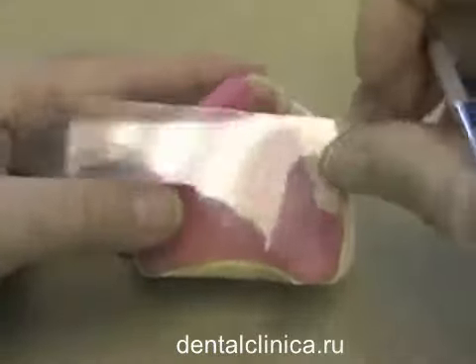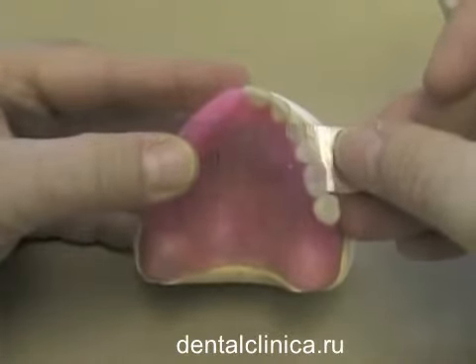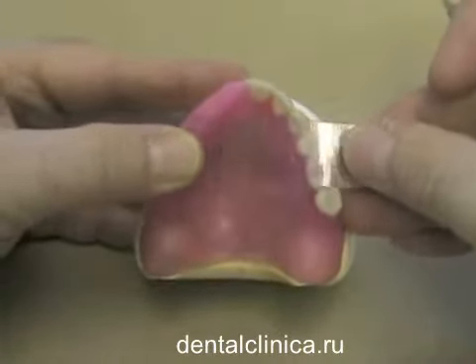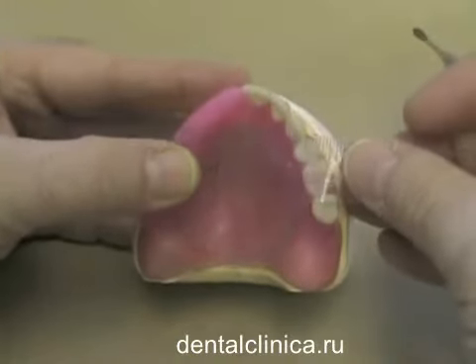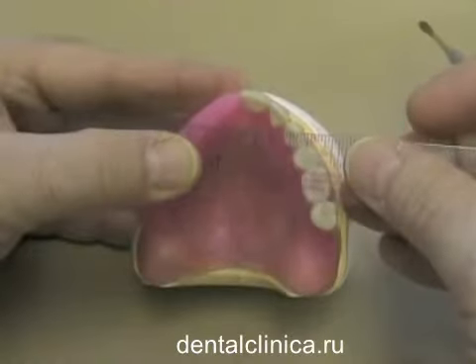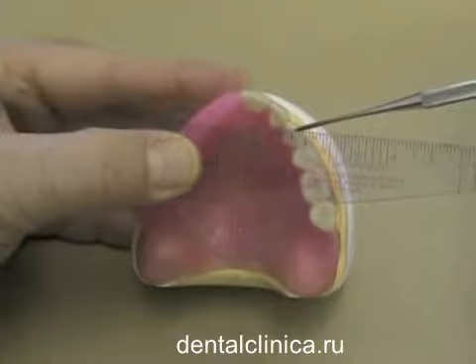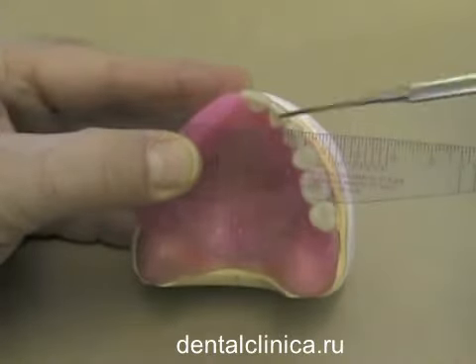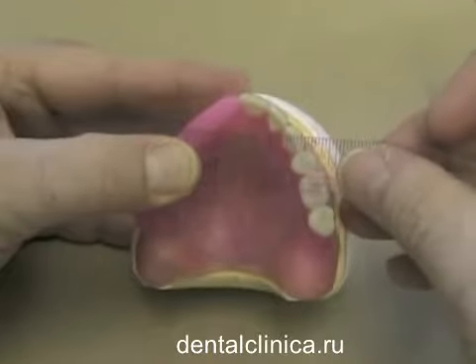That will help us when we want to determine where that anterior reference line distal to the incisive papilla is. If we line up our median line on the auto rule here and move it up and back until we line it up with our reference lines on the land area, those will give us reference marks for our canines, and we'll be able to tell if the canines are set symmetrically one side to the other.